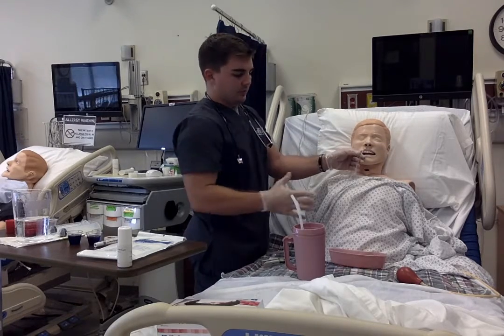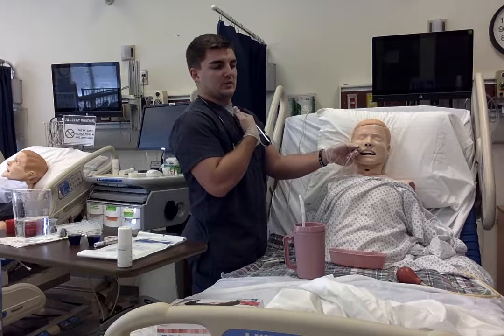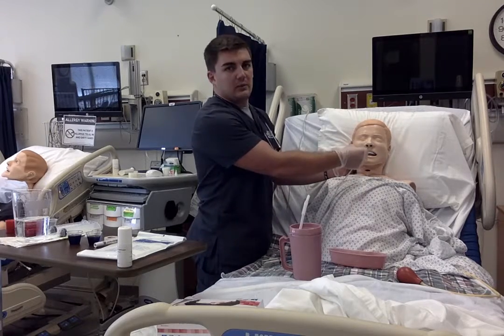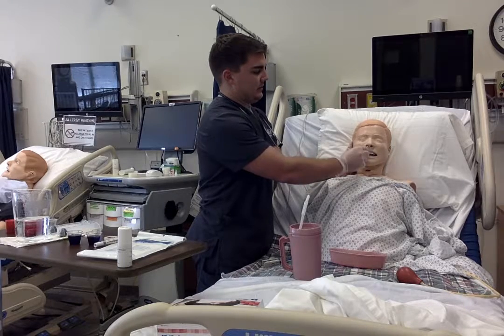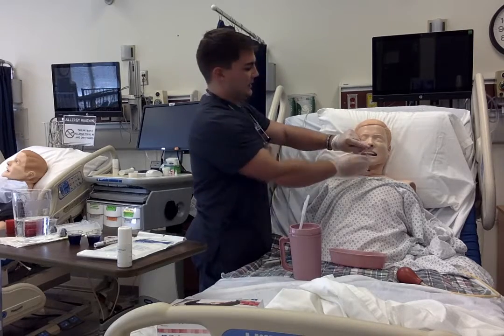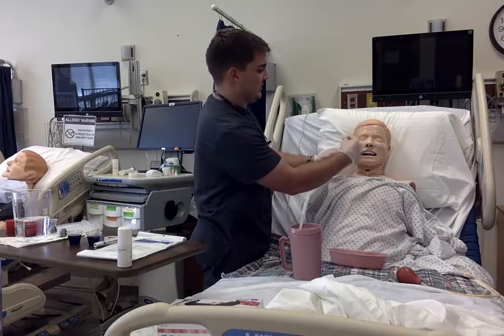Once I hit the oropharynx, I have them tilt their chin to their chest and take sips of water, and each time they sip water, I insert the tube farther, continuing to rotate the tube approximately 180 degrees.